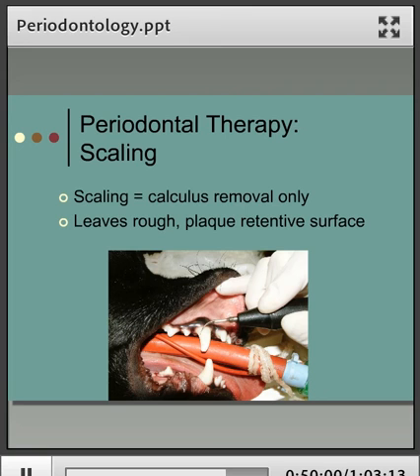So that way, unfortunately, by spending probably too much time on a tooth at any one time, you're in danger of heating the tooth up and thermally damaging your pulp. So instead we have plenty of water irrigating and cooling the tip. We have it on a low to medium power only, particularly in cats we'd have it on low, and we're only touching the side of the tip and doing the scaling for 1 to 2 seconds, I would say, at any time.